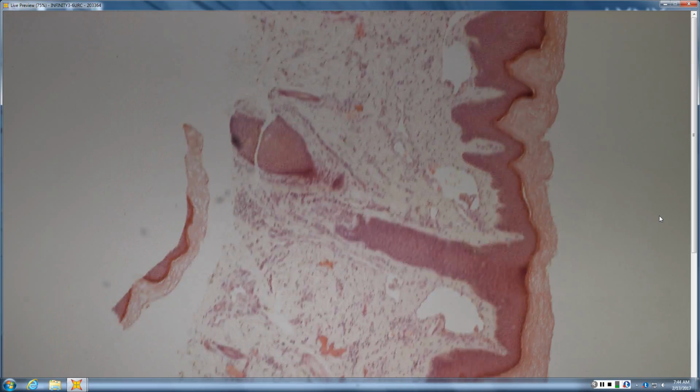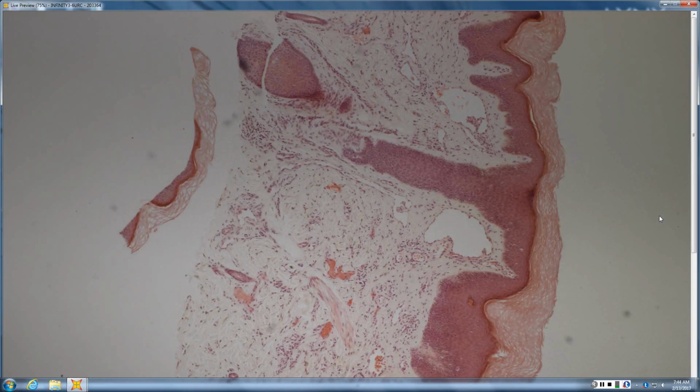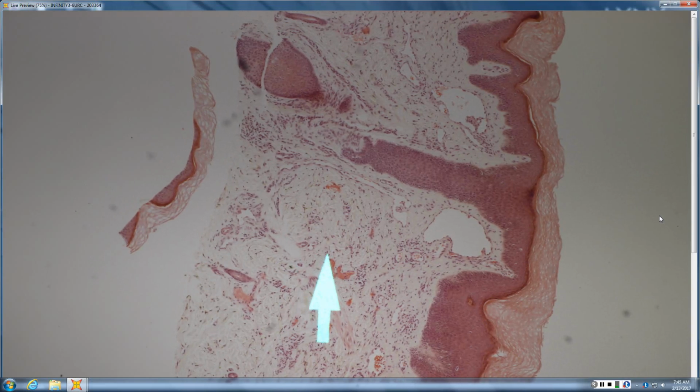But you noted that in addition to that, there's a busy dermis. And in fact, there is hemosiderin down in that busy dermis, and a little bit of vascular proliferation around pre-existing vessels. So this would be a good thing for an upper year.